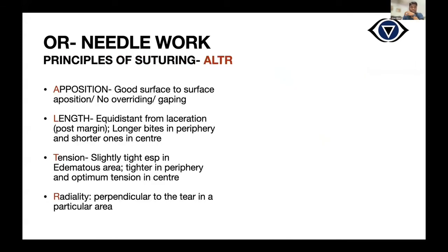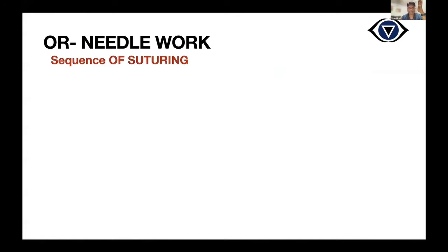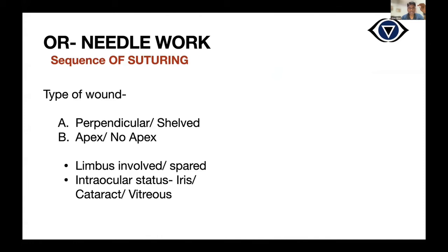So this is what the basic principles are: the apposition, length, tension, and radiality that you need to keep in mind while you are operating. What will be the sequence of suturing? So this will again depend on what kind of wound it is.